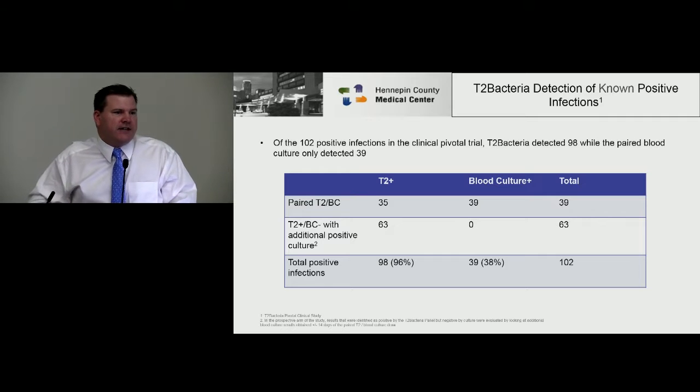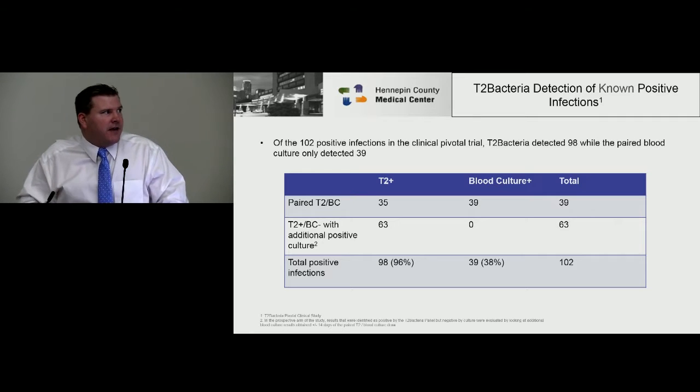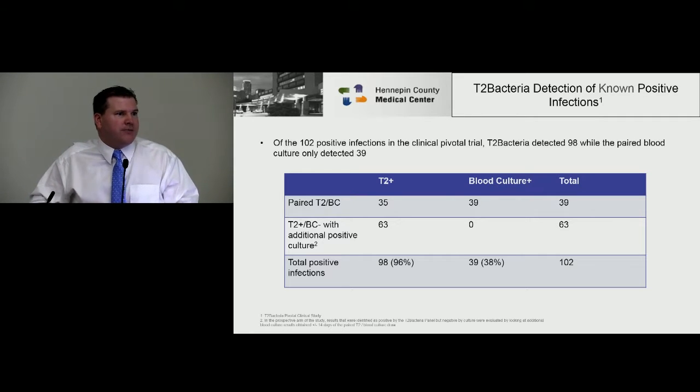And for many of these cases, in fact, for all of these cases, they met certain clinical bars associated with sepsis, including the use of additional high titer positive samples from other organs representative in a septic patient. So these cases are still under adjudication, but they're taken to be a further insight into the recognition of sepsis from a new diagnostic modality.